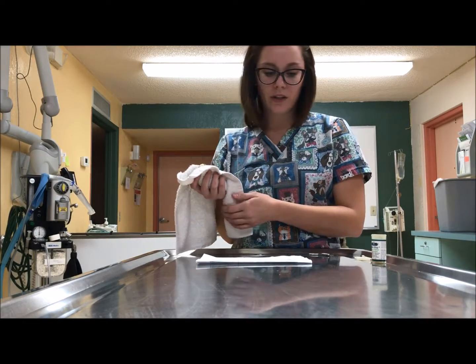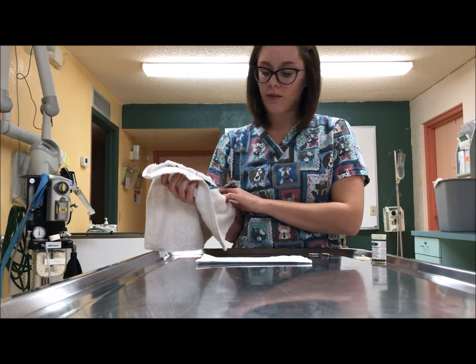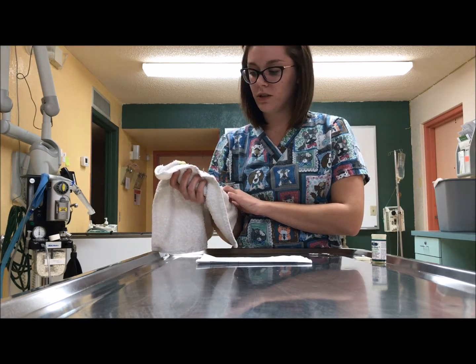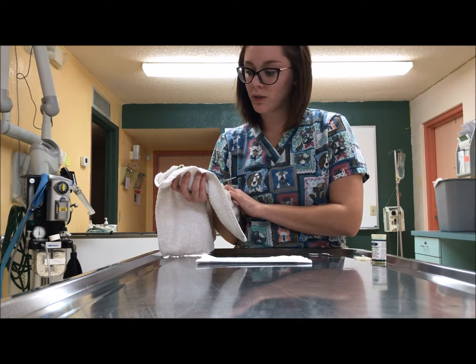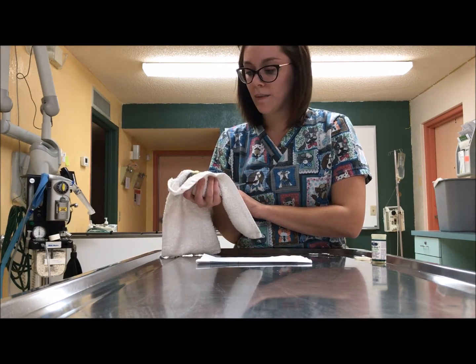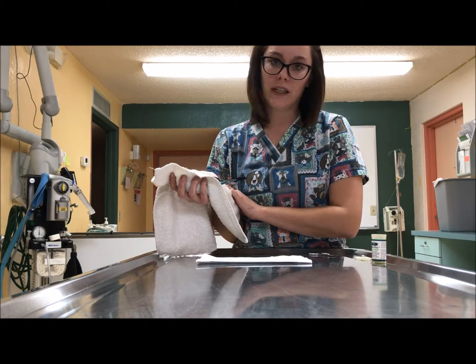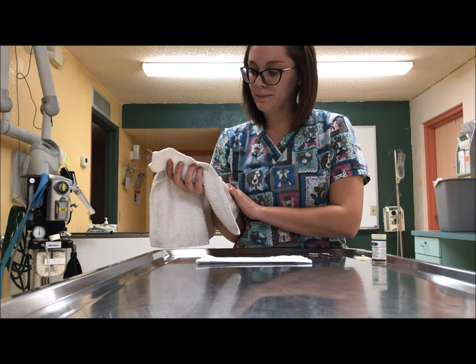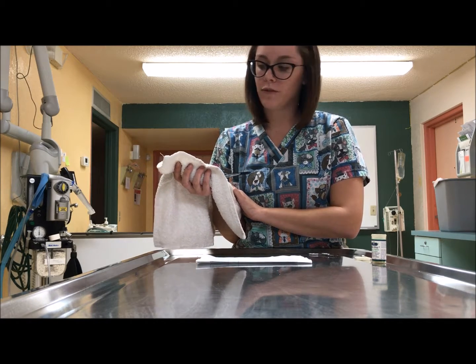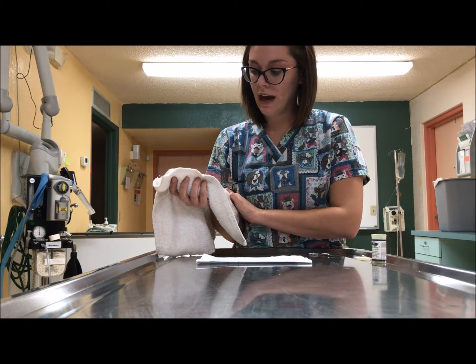All right, I'm going to talk to you a little bit now about some bird care. First off, we're going to learn how to do some restraint techniques. The easiest one I have found, especially for smaller birds, is using a towel. It helps calm them down, and it gives them something to nibble on and chew on while they are being restrained. There's also restraint boards for bigger birds, which are especially helpful if you're doing x-rays.